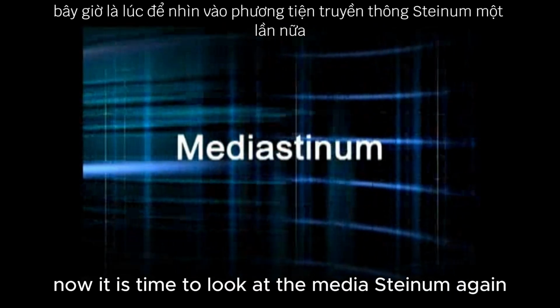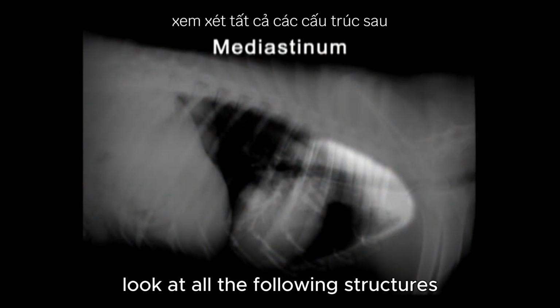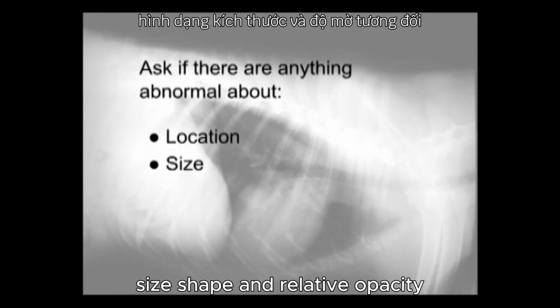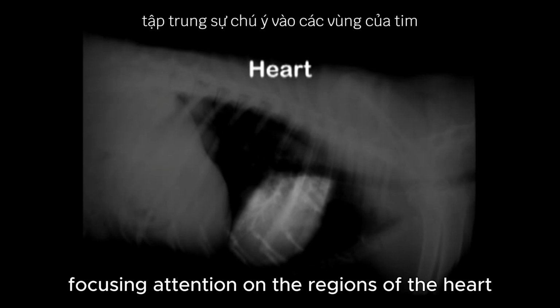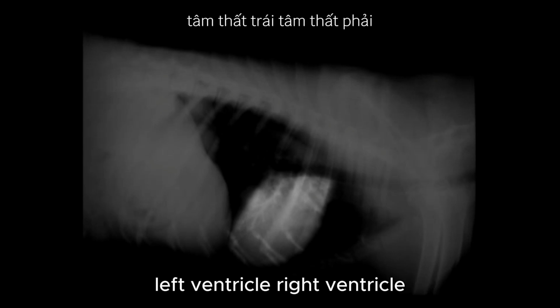Now it is time to look at the mediastinum. Again, look at all the following structures, always in the same order, asking if there is anything abnormal about location, size, shape, and relative opacity. Think about and look for the trachea, the heart, specifically focusing attention on the regions of the heart: left atrium, left ventricle, right ventricle.